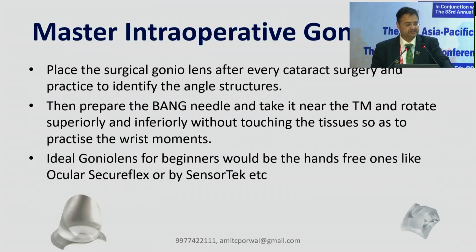So after placing the surgical gonio lens, how you're going to do this is, after every cataract surgery of yours, master gonioscopy first. This is very, very important. Always master gonioscopy, try to identify the structures.